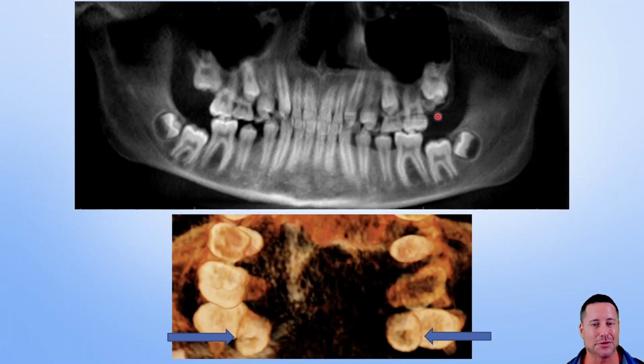So again, you send this patient for this procedure. Let's say that the oral surgeon doesn't take a separate image. It's a 2D, and they go in and they go to remove this tooth, and then you find out, I don't know, next time you take an image or a radiograph, that it's happening on the other side as well. Or maybe what would happen is the upper left 7 would be descending and the upper right wouldn't. So you'd be going, why is that upper right 7 not descending in line with the upper left? Take an image, and maybe at that point you could see it, or have to refer for a 3D. But again, why wouldn't you want to see this the first time?